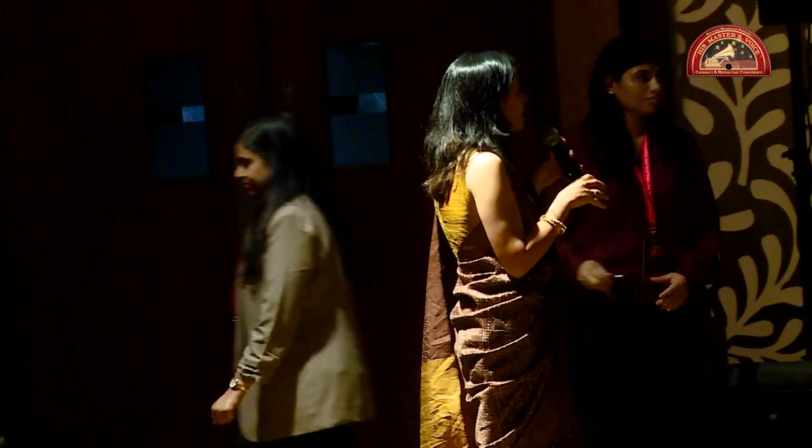The last live surgery of the session. That is a case of high myopia, which will be shown by Dr. Rohit Parkash.